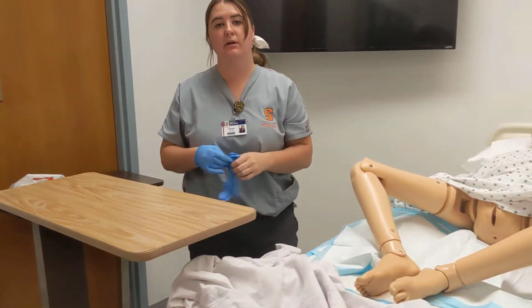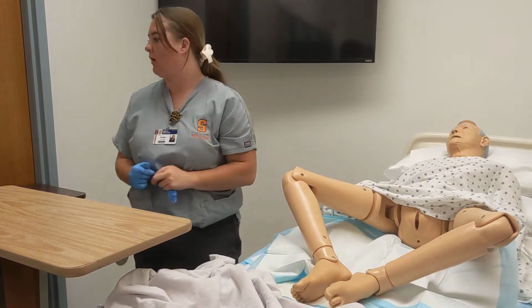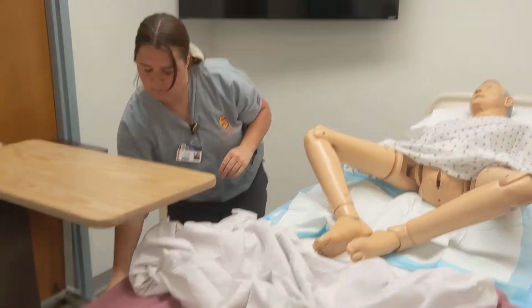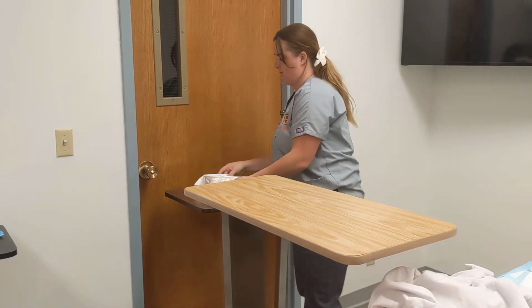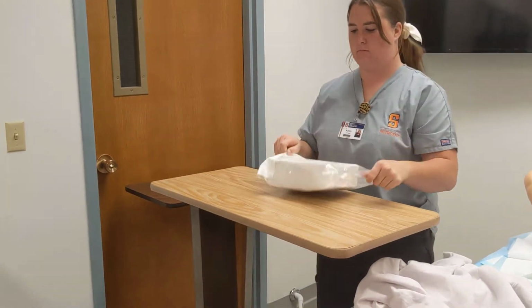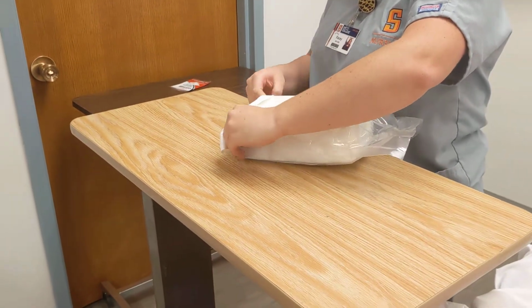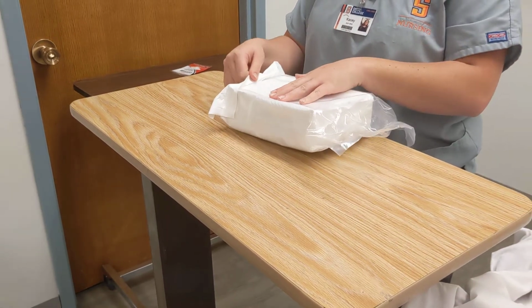All right, so what we're gonna do next is we're going to open up our kit, which actually I wash my hands, but we're not gonna put those gloves on because we're gonna be putting some different gloves on. We're gonna put gloves back on.